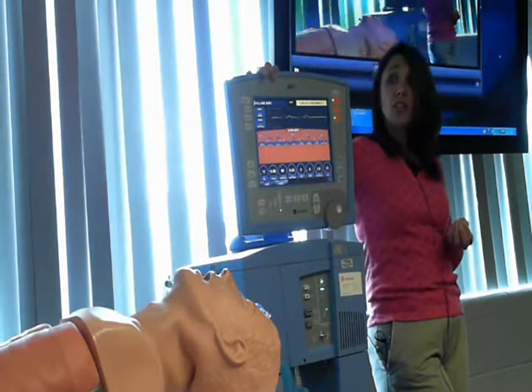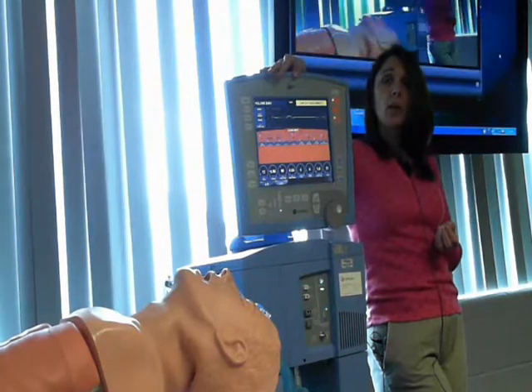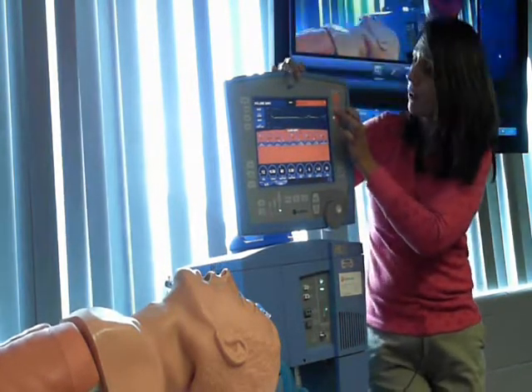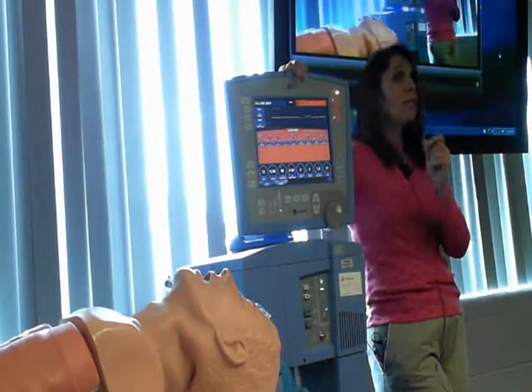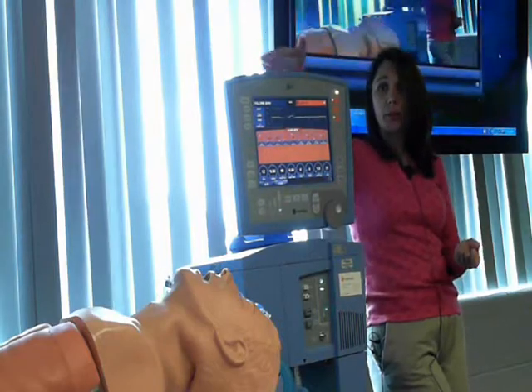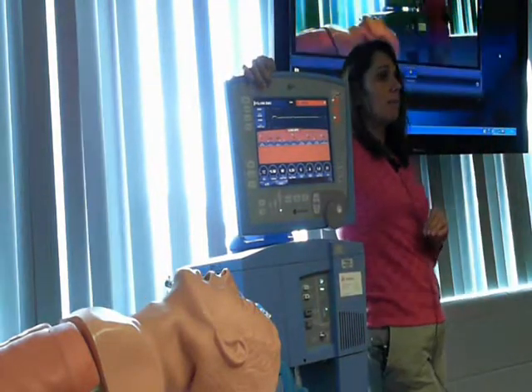However, the vent will recognize the patient's respiratory effort, and it will allow the patient to take a breath however they want to do it. So if they're still weak, they're allowed to take a spontaneous breath. That spontaneous breath may not be deep enough to take care of their ventilatory demands. So this is where you need to be aware, my nursing friends. And someday we may work together. Who knows? Watch your ventilator, okay?